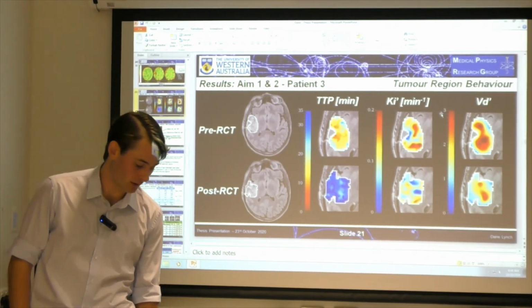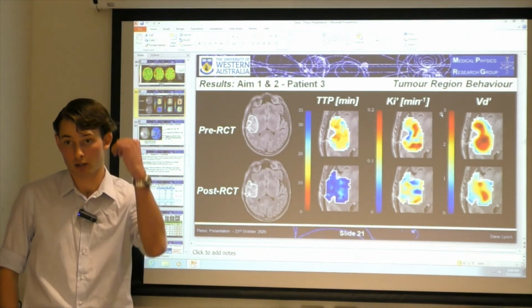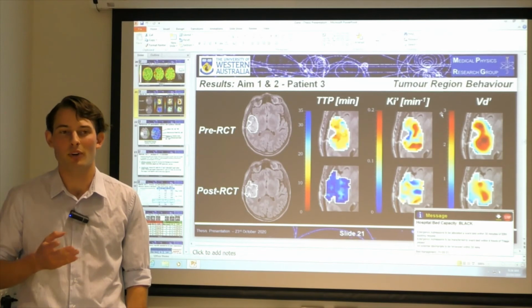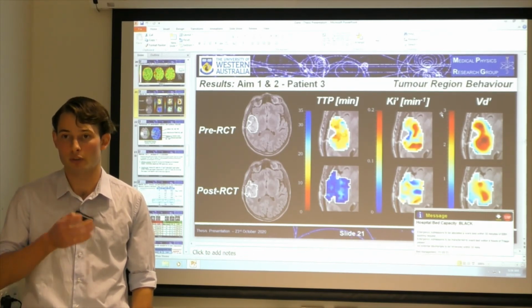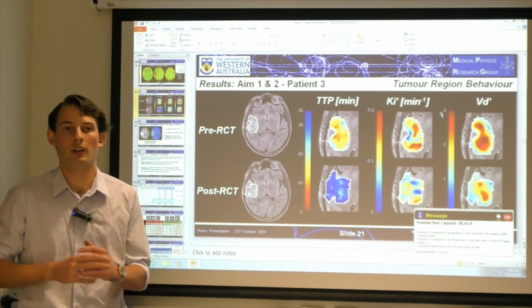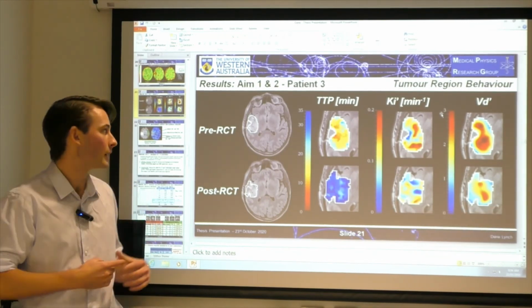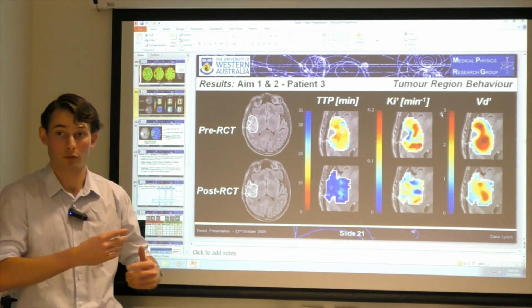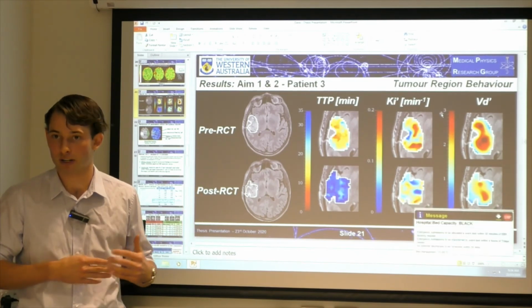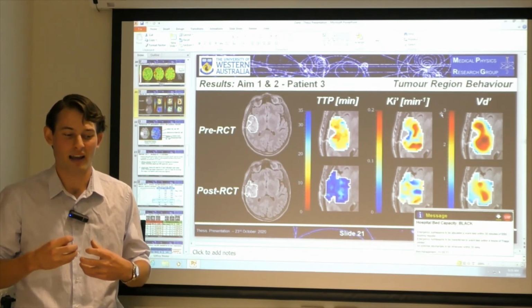So there's a lot of clinical areas which this could possibly be used for. Glioma grading is a big one, pushing towards non-invasively grading cancer as opposed to having to always perform surgery, which is quite invasive on the patient. Ideally though, we're pushing towards having a model that describes the best way to treat these patients. And so if you can take a scan following this surgery and look at all the features extracted from this scan, we can then form a model that best describes how to treat the patient.